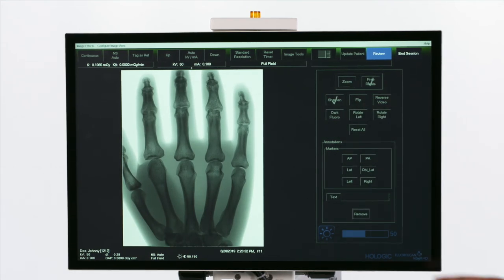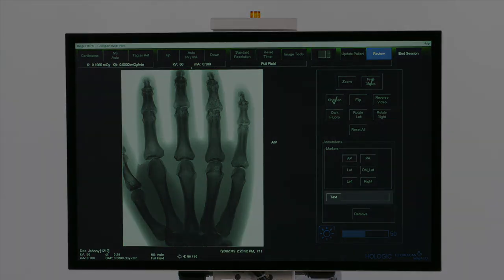Annotations can be used to mark the image. There are preset options, or an annotation can be manually typed.